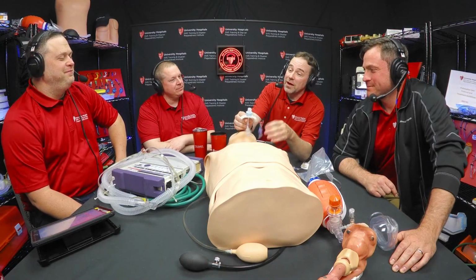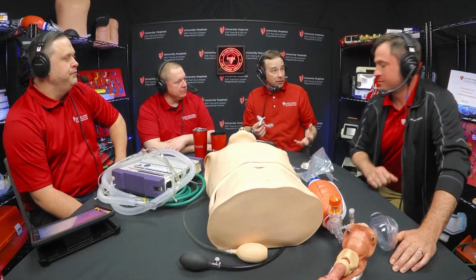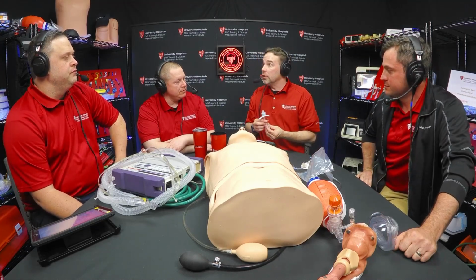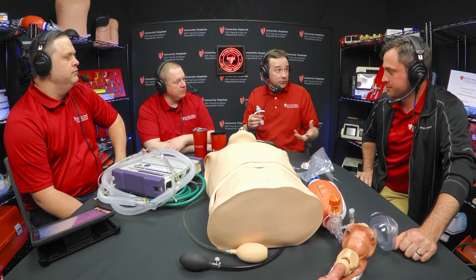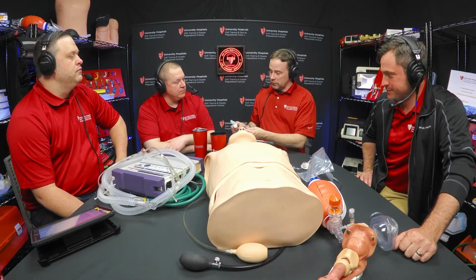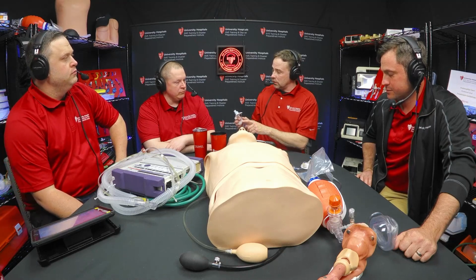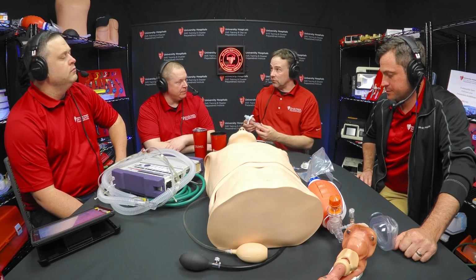But in that same thought process, if you are picking up a patient who is on a ventilator and has a cuffed tracheostomy, one of your first stops in assessment of the airway needs to be squeezing just that, making sure that proximal cuff has some air in it, which of course is telling you that this distal cuff is inflated, right?